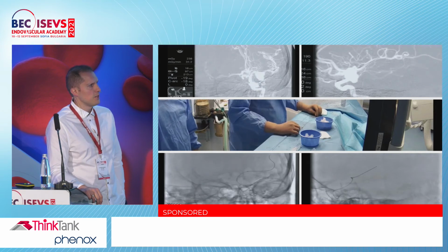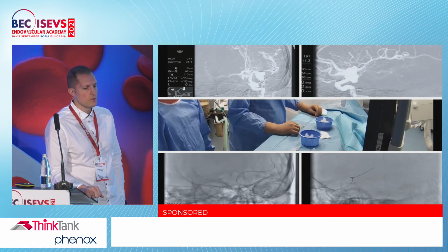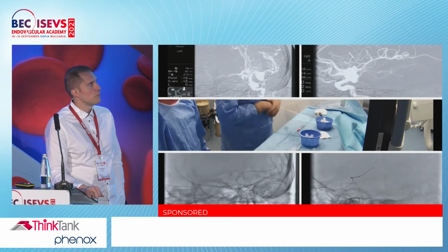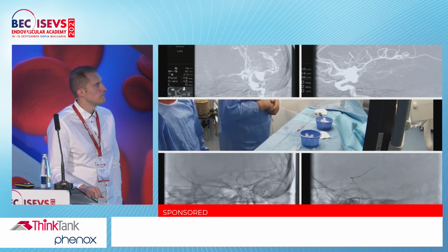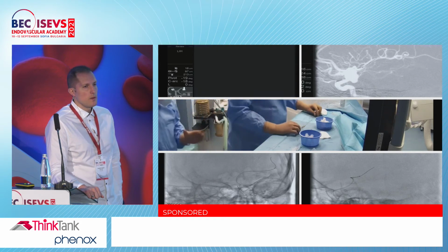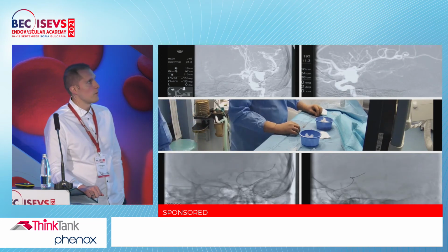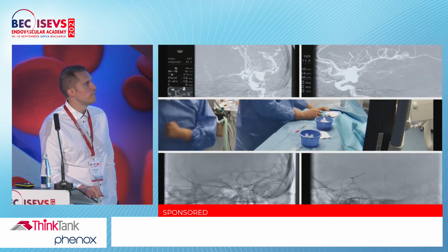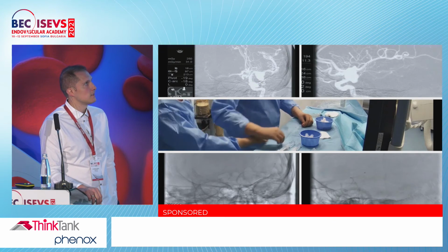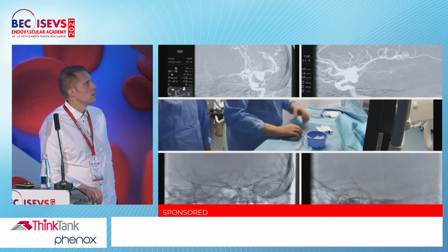It's a very long lesion. We have the same strategy here. We jailed the first catheter just to put several coils inside and to induce faster thrombosis. And this here is the microcatheter for the stent. We go to the healthy M2 portion of the left MCA. We used 4.5 by 27. It's a very, very long stent, but we really want to cover it correctly. And like I will repeat myself, we intentionally didn't want to cover the A1 origin of the left ACA.